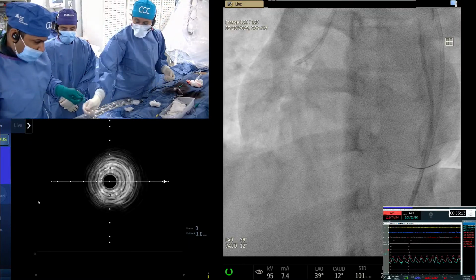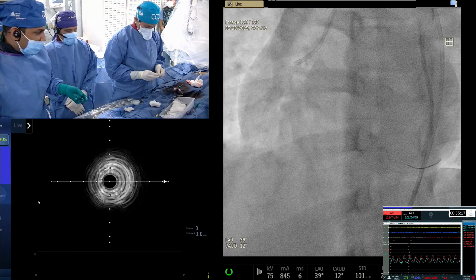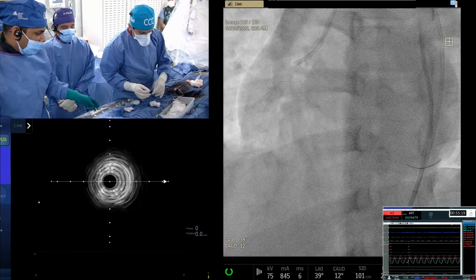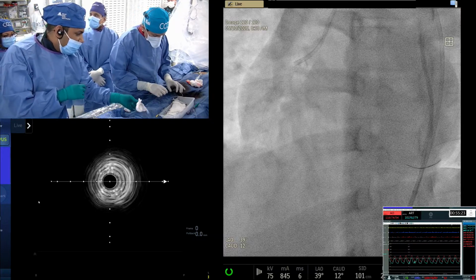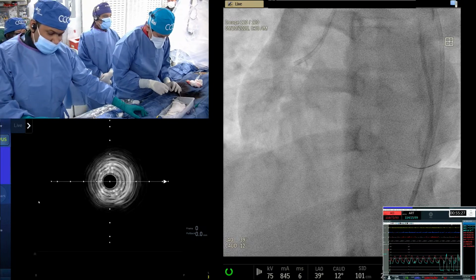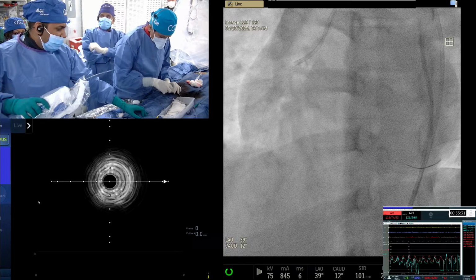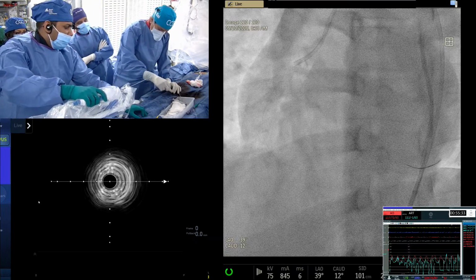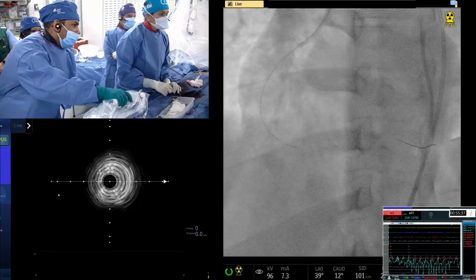Yeah, this used to be called the Nanto technique. We used to do it in the past. Then it became the trapper. Now we use side by side balloon. A lot of money has been spent on how to take the monorail wire out, or over the wire system with the single length wire. I would not do it for the stiff wires. That's the only issue that remains.